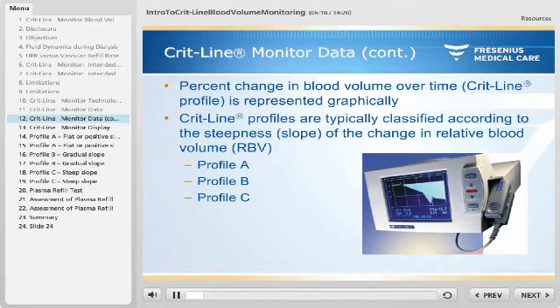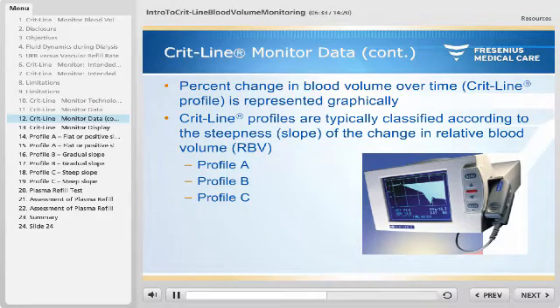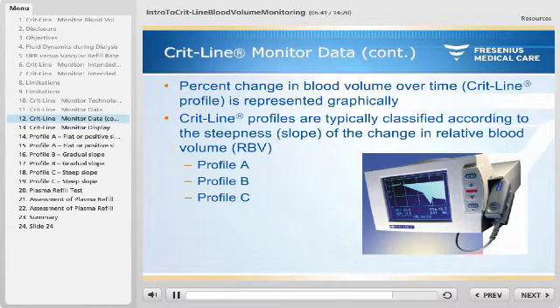In addition to each numerical parameter, the CRITLINE monitor also displays the percent change in blood volume over time graphically. This graphical curve of blood volume change over time is often referred to as the CRITLINE profile. CRITLINE profiles are typically classified according to the steepness or slope of the change in relative blood volume, or RBV, into profile A, profile B, or profile C.